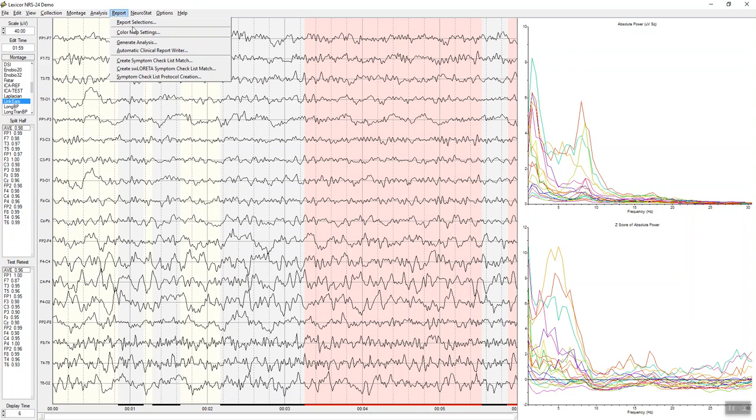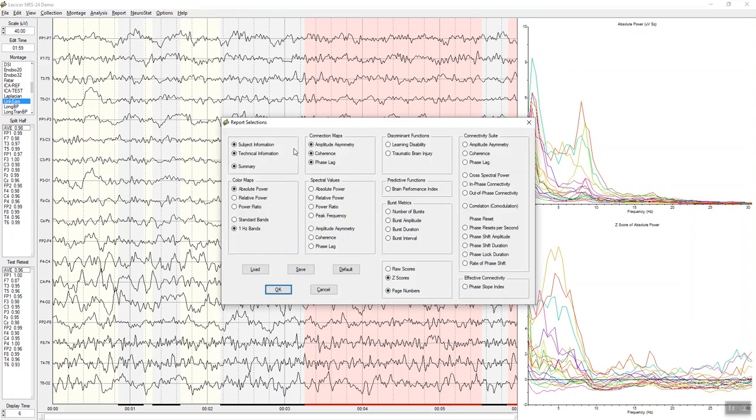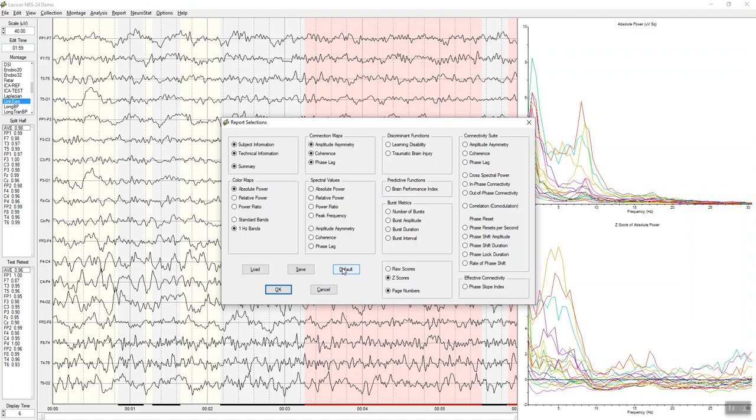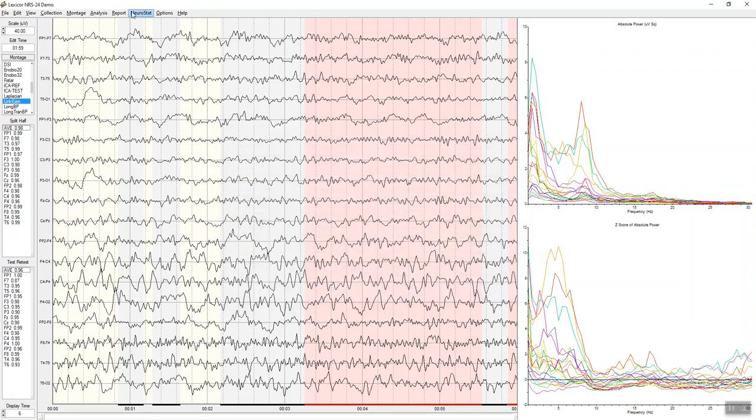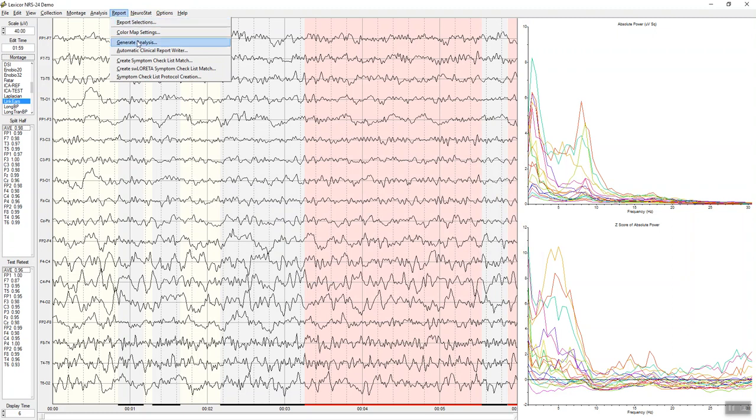We can then make reports, clinic reports. You can open up the report panel here and select whatever you want. In this case, it's one-hertz standard bands in absolute power with coherence phase. There's also a connectivity suite to look at things like phase shift duration, phase lock duration, shift amplitude, and discriminative functions of various types, as well as burst metrics, brain performance index. You can click default and save whatever you select here. Or you can save special selections, click OK, and then you're good to go. The report also here allows you to create analyses with maps you save in the subject's folder.